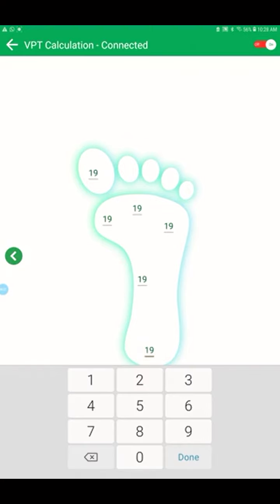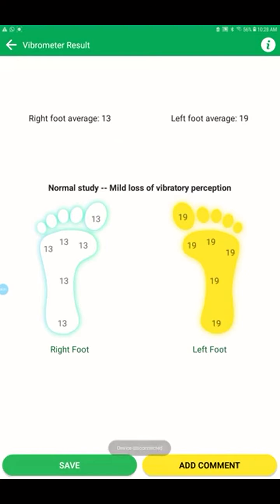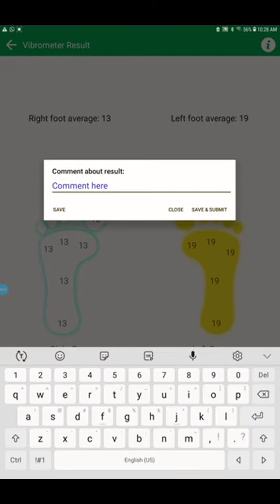Once it's done, it asks to calculate. So you can see the result. The average is there, and the color of the foot changes depending upon the interpretation. Normal in white, mild in yellow, moderate in orange, and severe in red color. Okay, if you want to add any comment, you can add the comment here, say testing VPT. You can add your own comments.